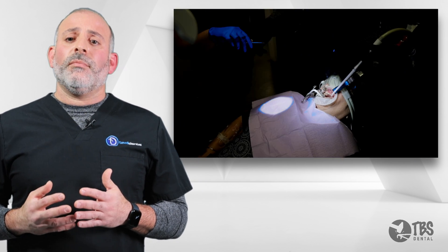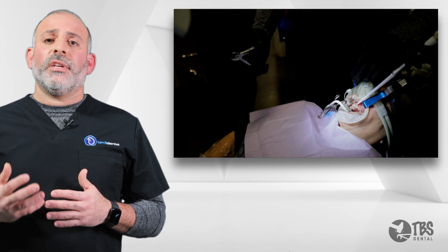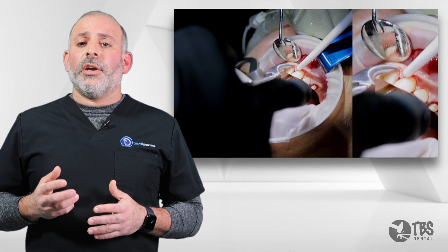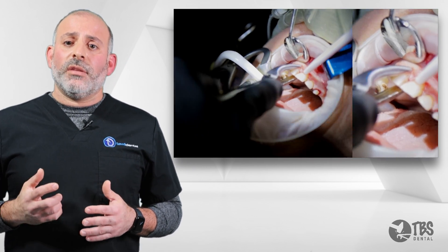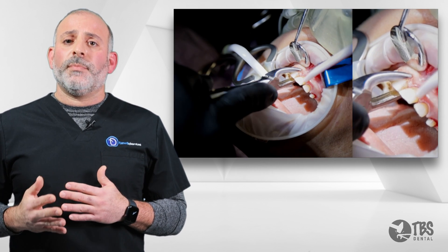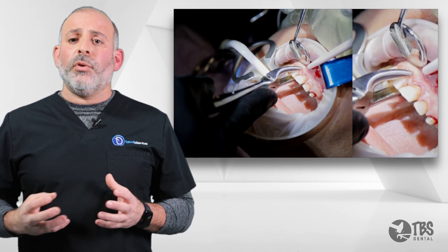After using the Elvatome, we can simply pick up our Fring's forceps and then providing slight rotational movement with a comfortable ergonomic grip, keeping our finger on the hinge to be able to provide deeper and deeper access into that periodontal ligamental space, expanding the bony housing.